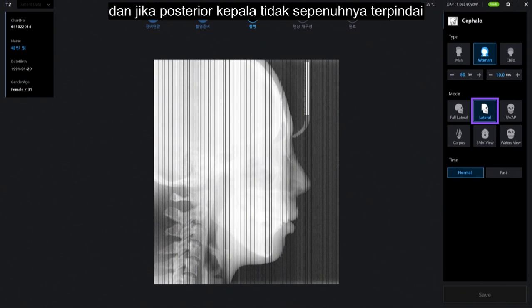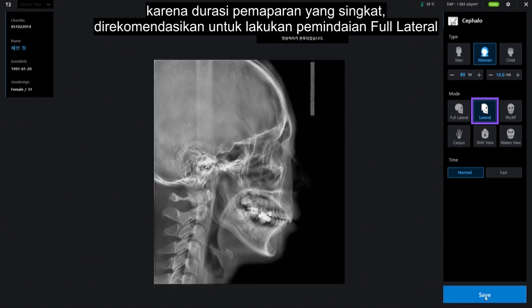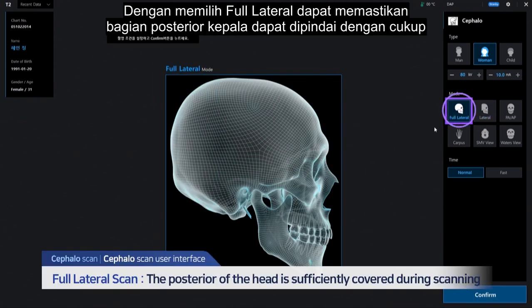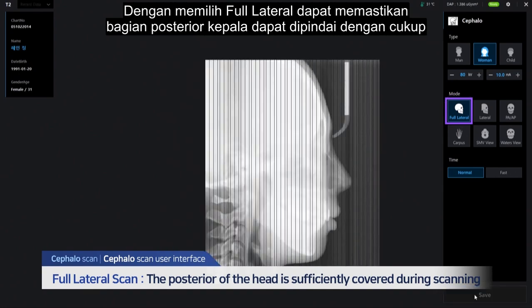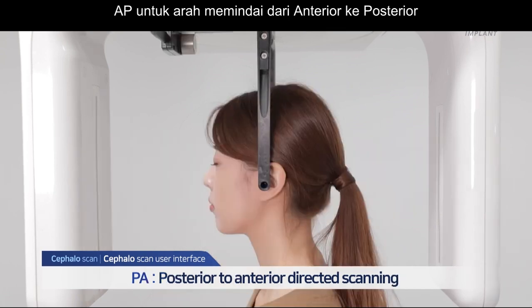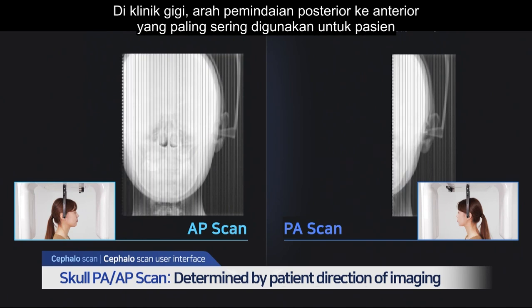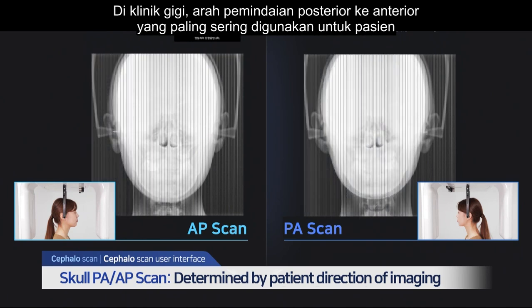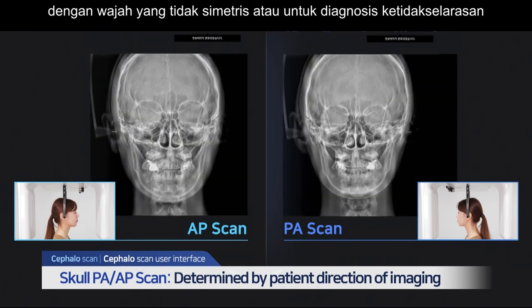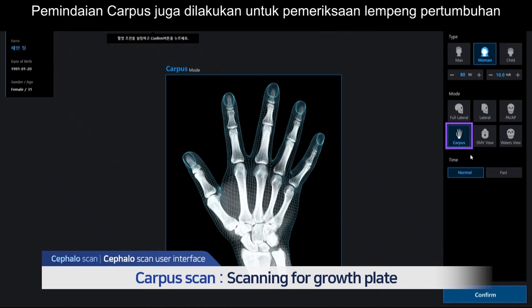And if the posterior of the head is not sufficiently covered, due to a short exposure time, a full lateral scan is recommended. Selecting full lateral ensures sufficient coverage of the posterior of the head for scanning. Skull PA or AP scan are selected depending on the direction of the patient's scan. AP is for the anterior to posterior direction, whereas PA is for the posterior to anterior direction. At dental clinics, posterior to anterior direction scanning is mostly used for patients with an asymmetrical face or for an alignment diagnosis. Carpus scans are used for checking growth plate.